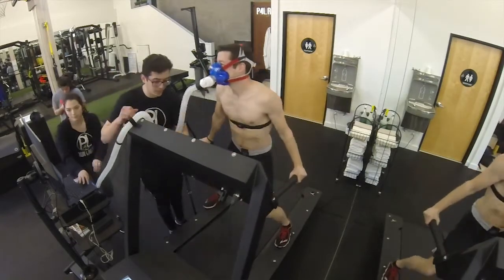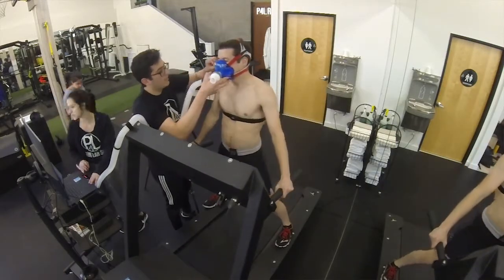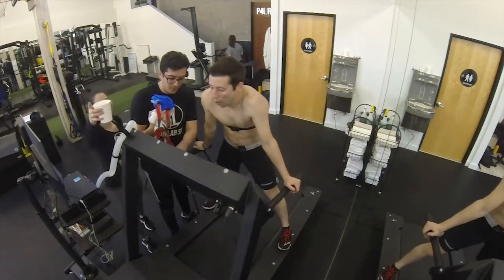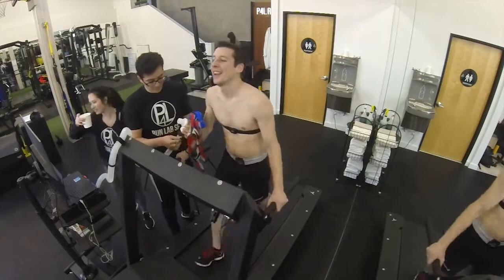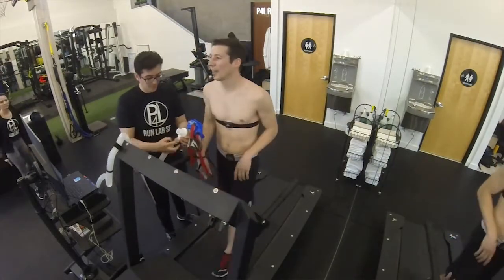Done, perfect, good job, good job. All right, I'm gonna lower this down. Come on over, let me take this mask off. Nice deep breath, nice deep breath. There we go. So I want you to go ahead and walk for me, okay? Don't worry, it'll slow down. Go ahead and walk. There it is. Some water. Good job, yeah. Just try and walk naturally.